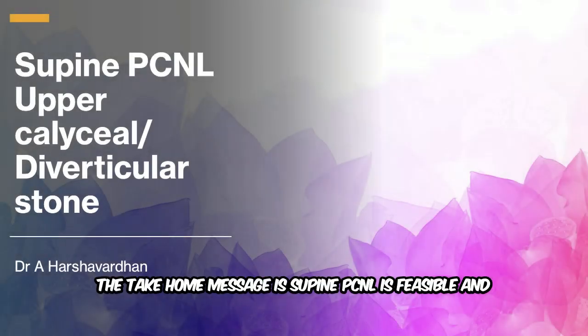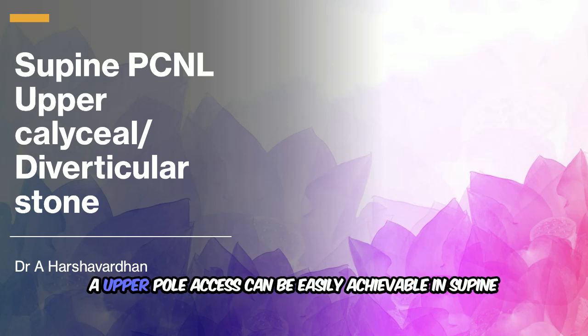The take-home message is supine PCNL is feasible, and an upper pole access can be easily achievable in supine PCNL and can be safely performed under spinal anesthesia.